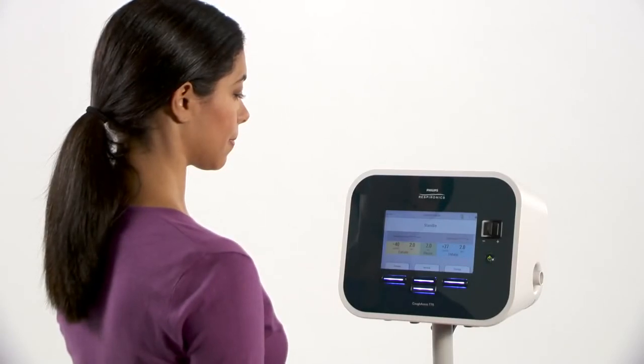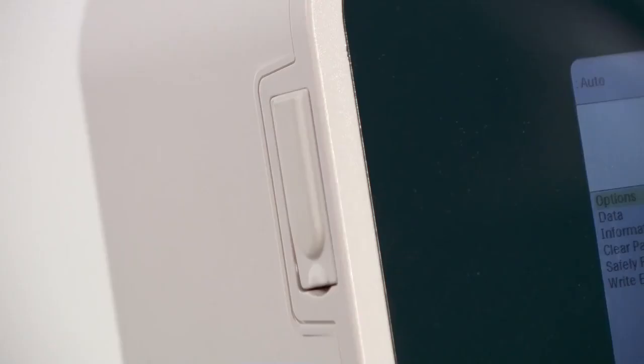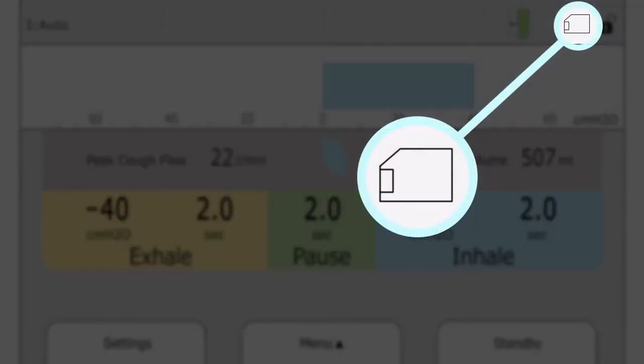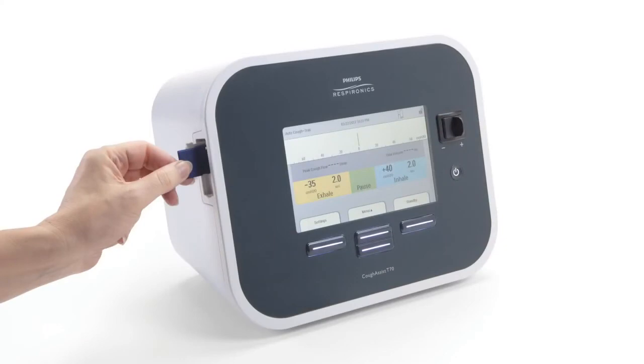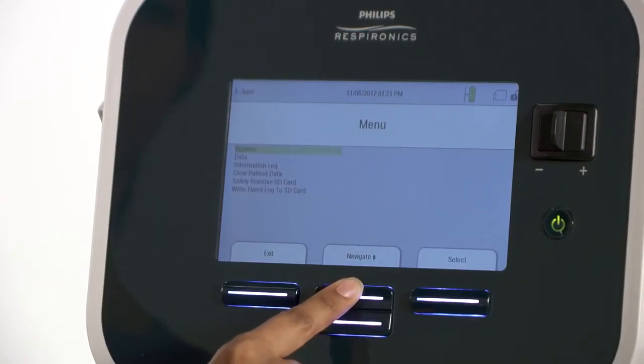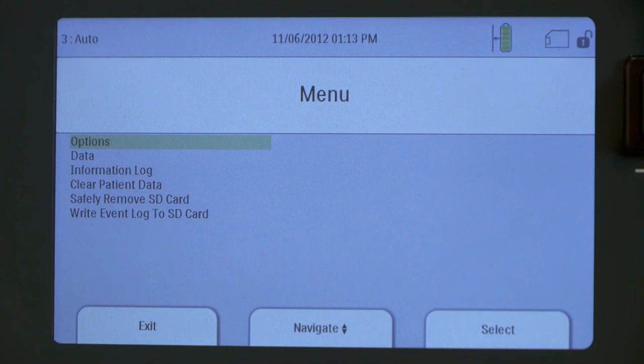CoughAssist T70 comes with an SD card inserted in the SD card slot on the side. An SD card icon will appear on the top right corner of the screen. Your clinician may ask you to remove this card in order to review information about your treatment. From the standby screen, press Up on the center button under Menu. You will see a list of items.